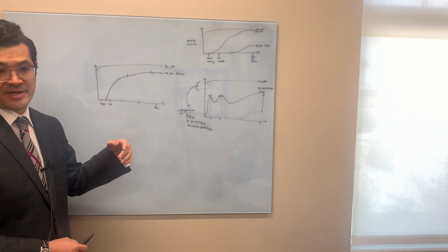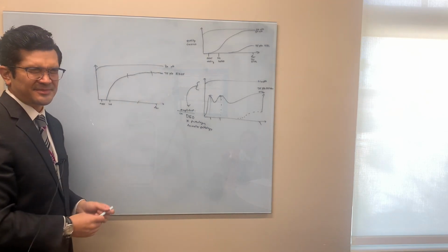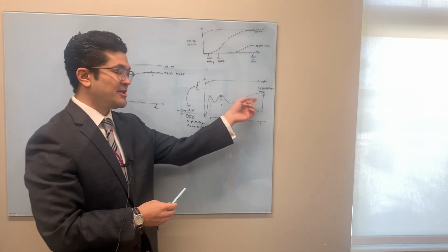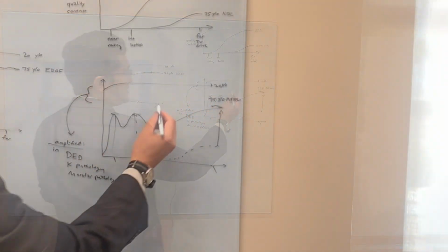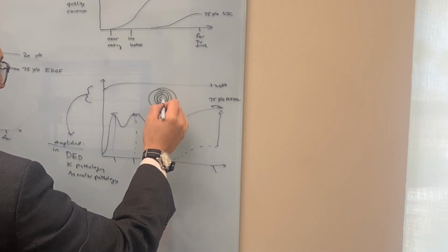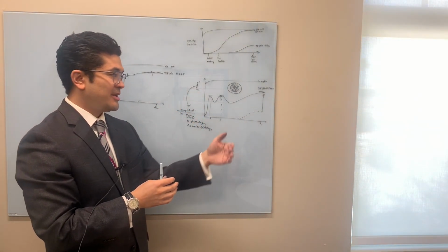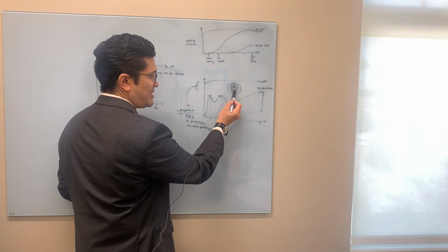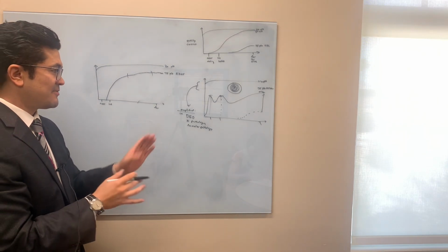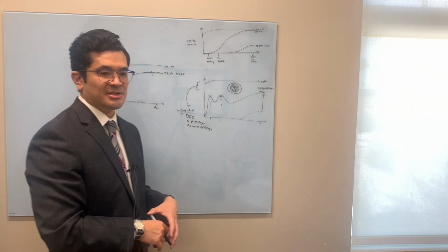We didn't want to sacrifice and have the issue of that gap from best possible by splitting the image or stretching the image focus with an extended or multifocal. Remember, the multifocal lens classically has little rings of focus. Each ring is going to split the light from near, intermediate, and far. This ring will be near, this will be intermediate, this will be far, and so on. You are actually overlapping several focus points altogether, and it does cause some image degradation.